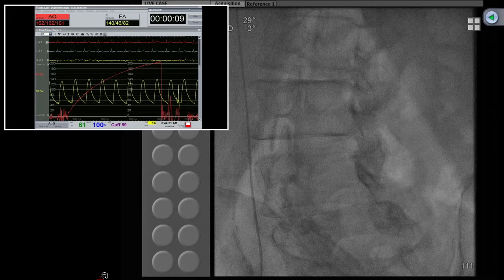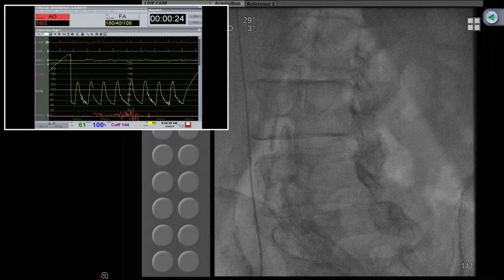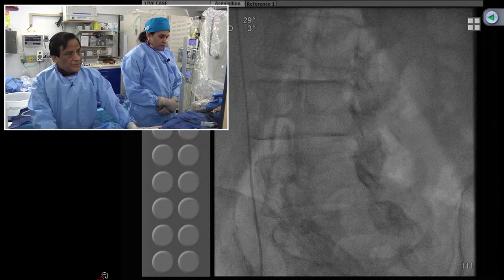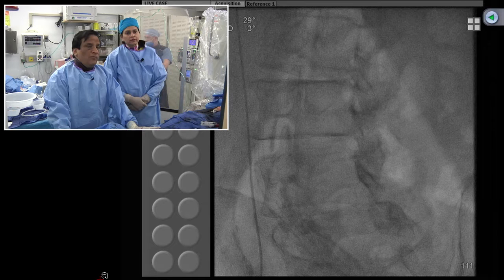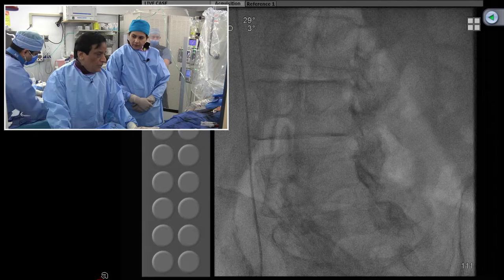The blood pressure and everything is stable to proceed with the PCI. We will not measure the cardiac output and PA pressures again. The same patient with depressed LV function is a totally different situation hemodynamically. The 65% EF here affords us a lot of protection. There is a new balloon called TrueFlow — essentially a perfusion balloon — so during valvuloplasty there is still flow across. We still need more experience before making any opinion about TrueFlow.